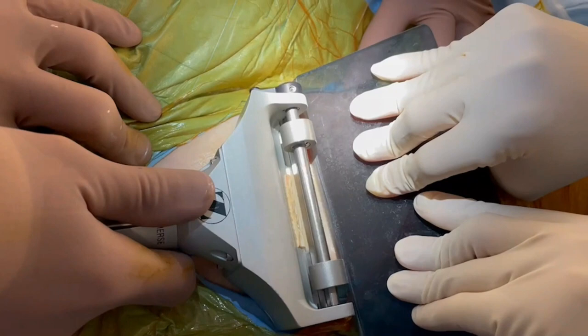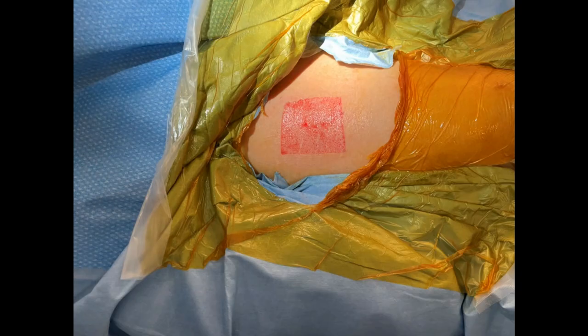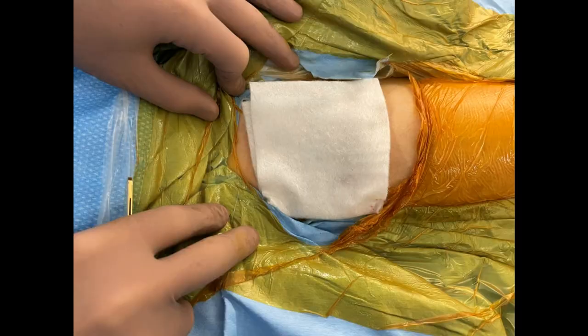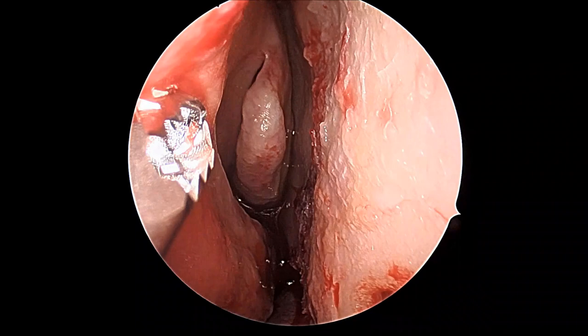The right thigh is prepared and a graft is taken — a split thickness graft, approximately two inch by three inch. After harvesting it, the donor site is dressed immediately with Gelinet, Calderstat, Curlix, Combine, and then Hyperfix to tightly keep the dressings in place. Now the area has been prepared.